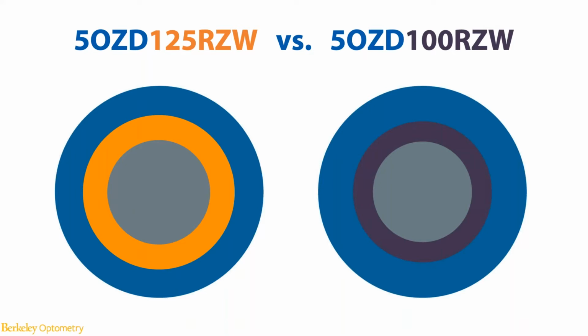While we're waiting for more solid evidence from more rigorously designed, hopefully randomized clinical trials, a thorough understanding of how the design differences transfer to corneal changes, and again, one step further, its impact on retinal defocus profile is extremely helpful in guiding lens design modifications. So related to this study, we aim to answer the following questions.